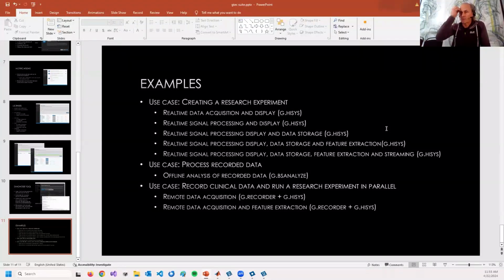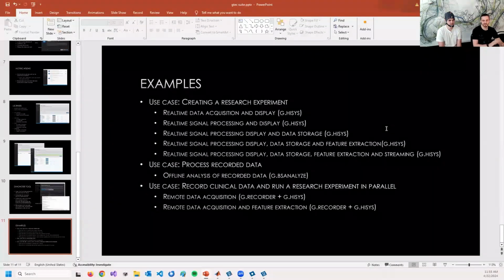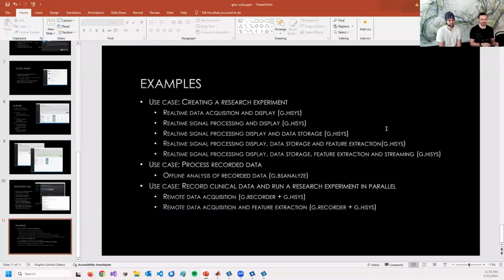Thank you very much. Then Martin is asking, is it possible to stream the data of two Unicorn devices at the same time? Yeah, should be possible. The Bluetooth interface is a bit limited, so I've tested two devices already. Sometimes with three, the Bluetooth is overwhelmed already.